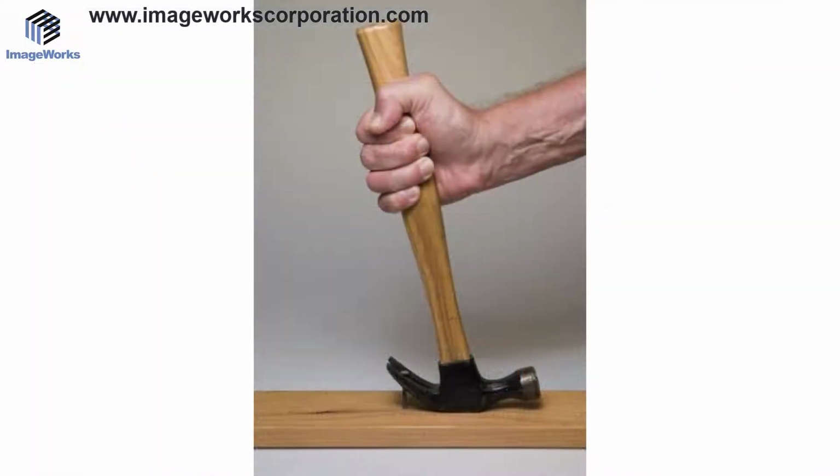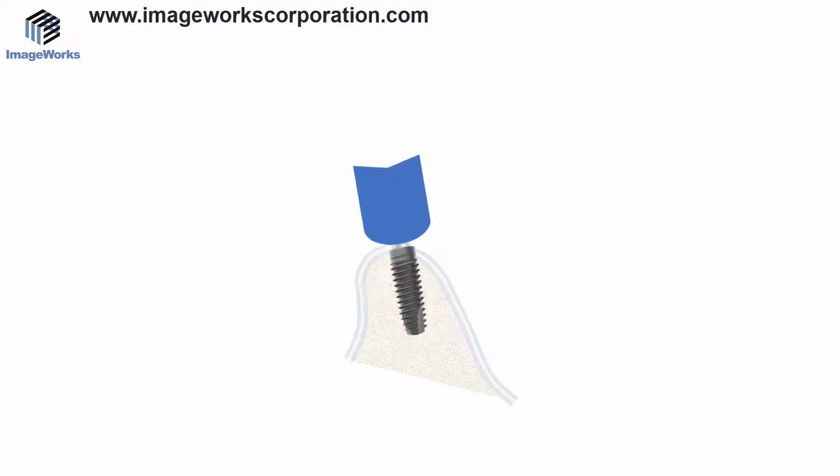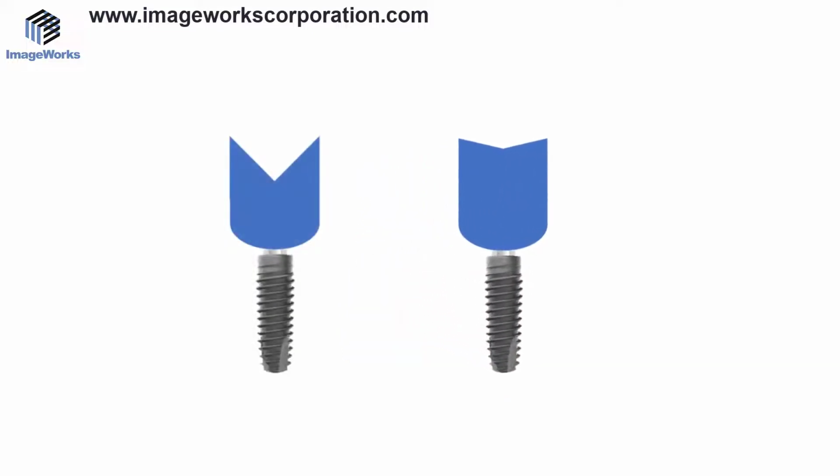To begin, it's worth a reminder that torque is essentially a force multiplier. If you have ever used a crowbar, you know that relatively small forces applied at some distance from a fulcrum can result in very large forces on the other side of that fulcrum. In this video, we wanted to zero in to show how this concept comes into play with design of the cuspal inclination angle of an implant. In this case, we're going to compare a force diagram for a simplified implant model with two different cuspal inclinations.